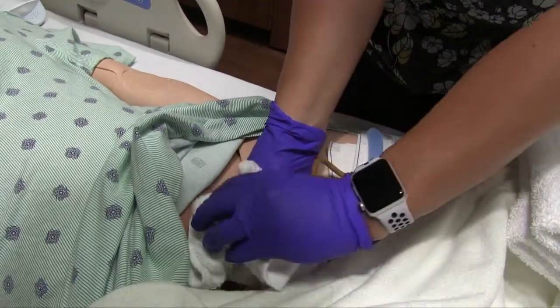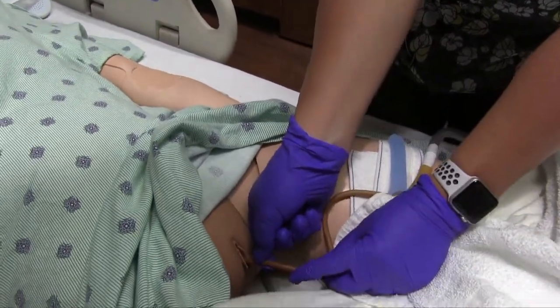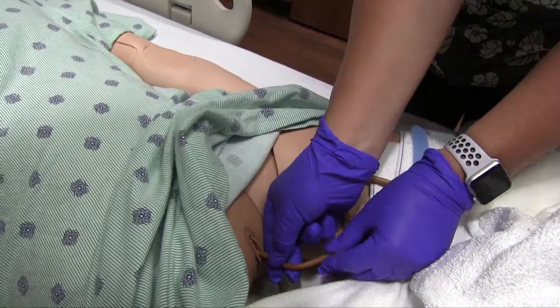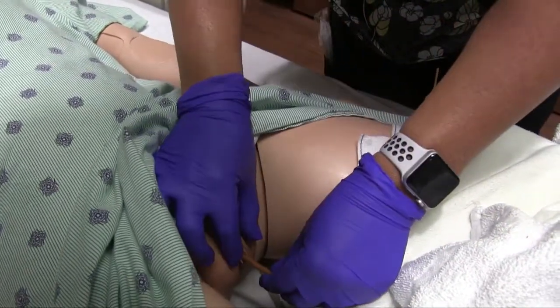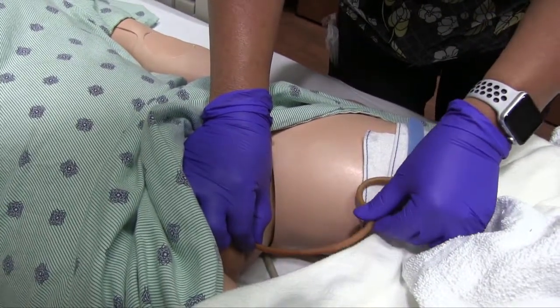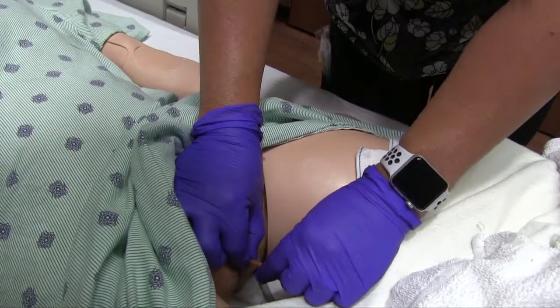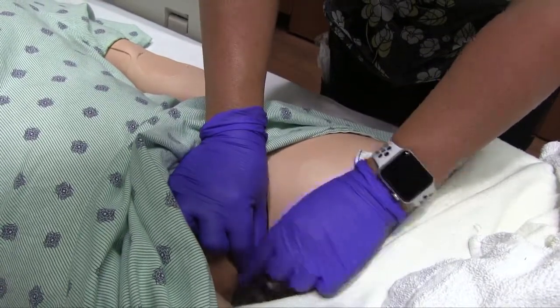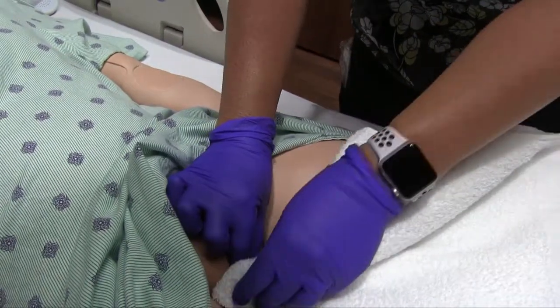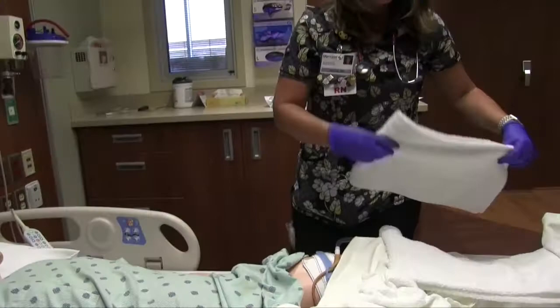Then you're going to rinse the same area, okay, with a new rag or your fingers, whichever you prefer. Get them good and soapy, or the rag good and soapy, and scrub the tube. Hold the tube in place with one hand, scrub with the soapy fingers, and the most important thing during this is you are scrubbing away from your body, because this is an open reservoir for bacteria, so you need to get those away. After you've scrubbed, you rinse it real good. You come in with your towel, you pat everything dry, and that's that. Any questions over any of that?